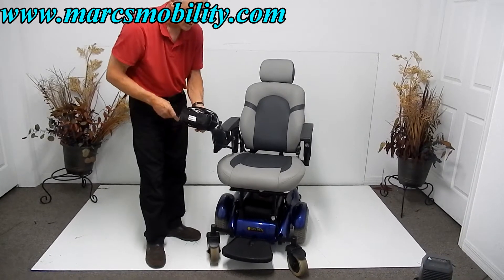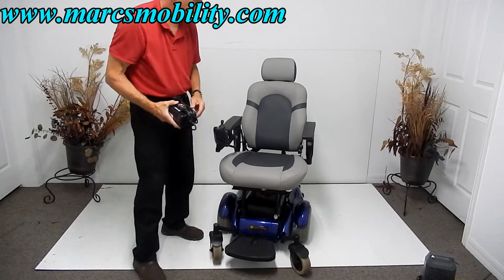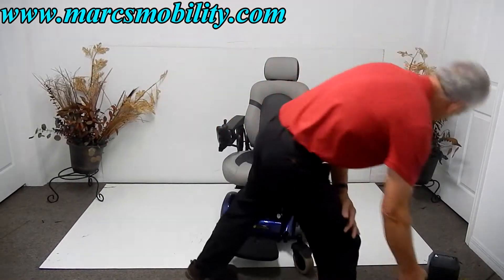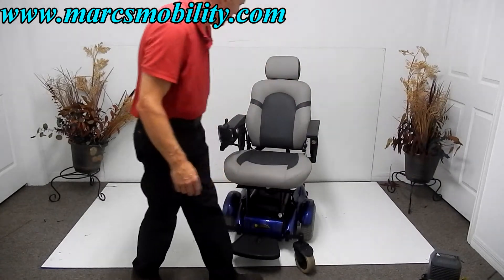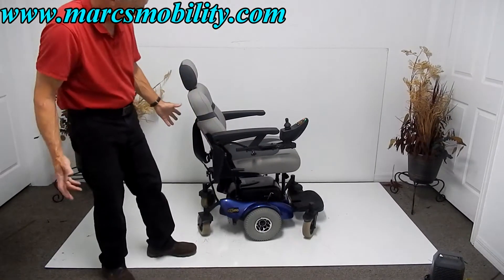To charge this chair, simply plug your charger into the joystick. The light turns green on your charger when it's fully charged. The charger recognizes when the batteries are full so you don't have to worry about overcharging — it will stop charging automatically.